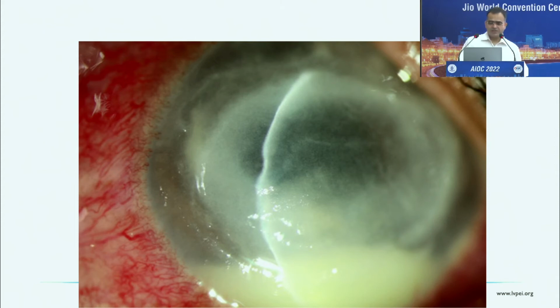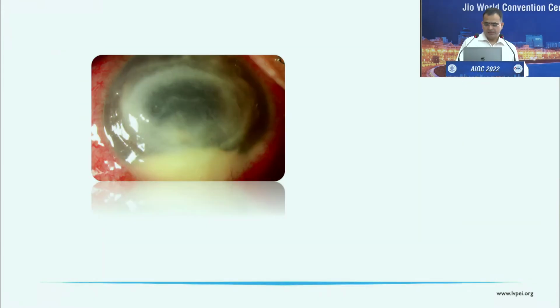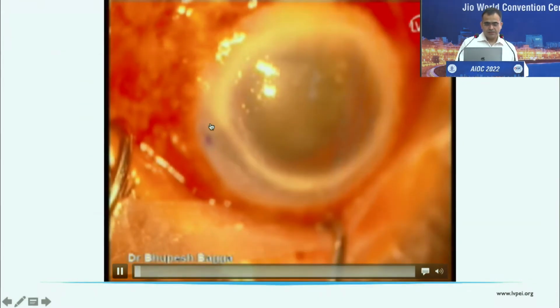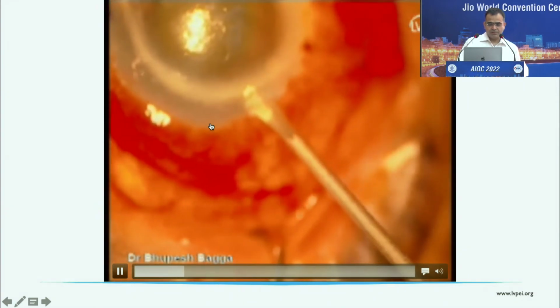As usual, we see the scleral inflammation in the Acanthamoeba keratitis is inflammatory. We go ahead. We think about going for performing keratoplasty. And this is basically the largest Acanthamoeba therapeutic DALK which probably I performed, of 11 millimeter.